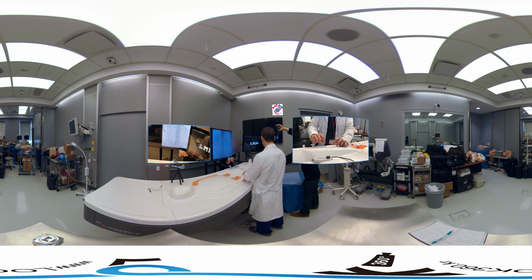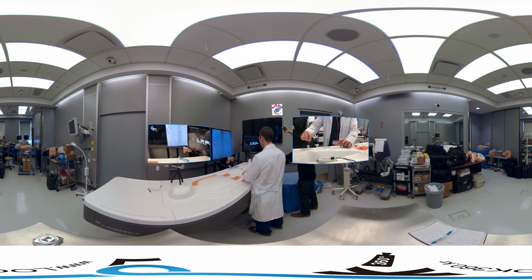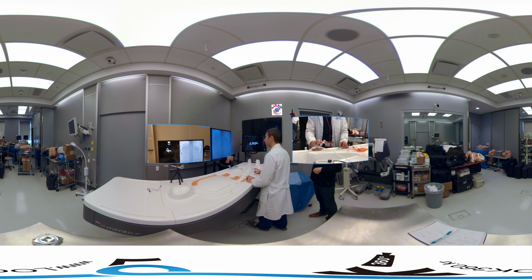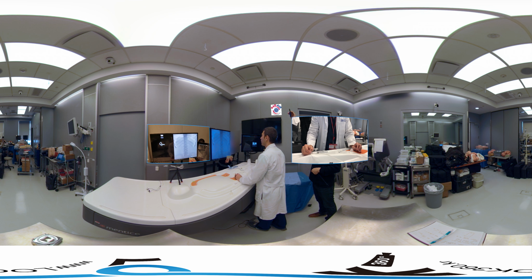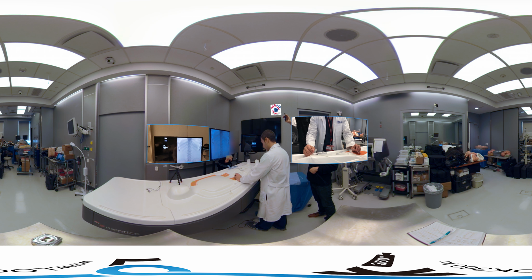And if you have an inner dilator in, you can inject through that, or you can inject through the side arm of the sheath. Now we can do a quick test to see if we're in a good spot. We'll do a quick pop here on the injector. And we see we're in a good position. I'm going to pull back just a little bit so I can see a little bit of inflow from the other side. Pop again. Looks like it's going to be pretty good.